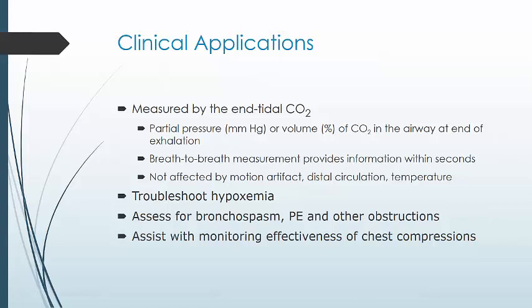Now, what we are measuring with end tidal CO2 is the partial pressure of CO2 in the airway at the end of exhalation. So it directly correlates to the CO2 in the cardiovascular system. This is why we're measuring it. The good thing is that breath-to-breath measurement gives information almost instantaneously, within seconds.